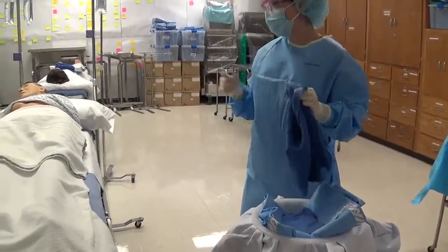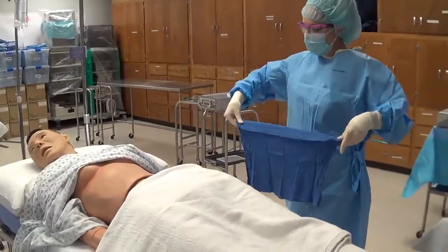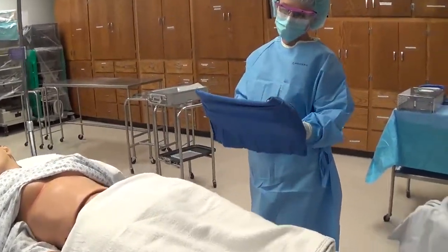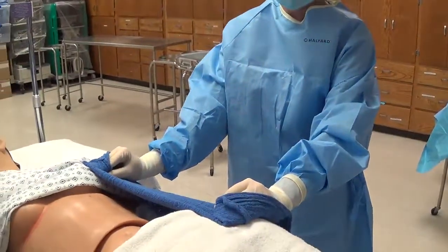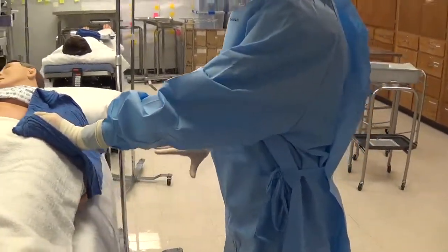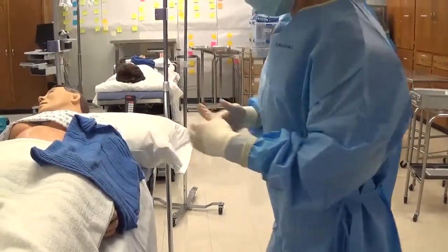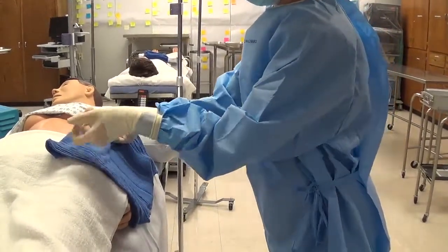First we're going to square off the patient — we assume the patient has been prepped; we're doing an abdominal case here. As you square off, make sure your hands are cuffed adequately so they're protected on the sides, and as you approach, watch the front of your gown. We have all these unsterile things here, so you can't belly up until you get the drape on — stick your butt out and give yourself extra space.